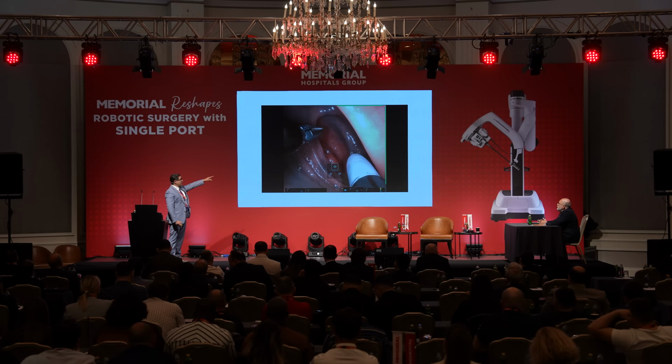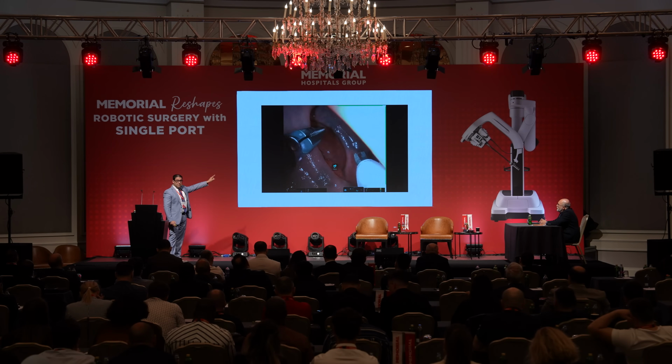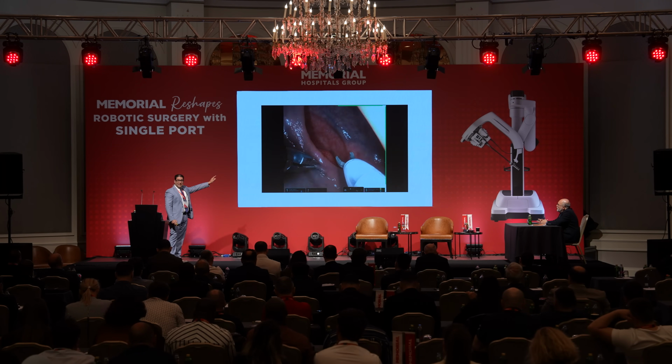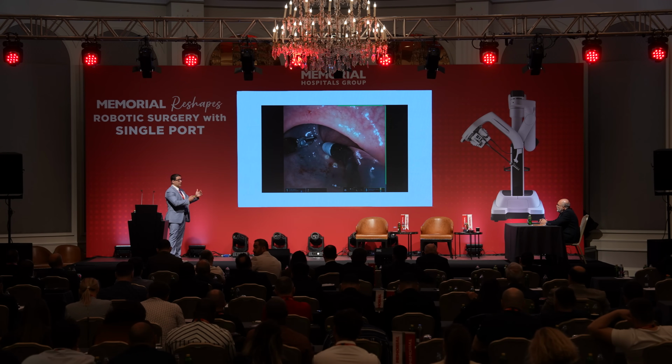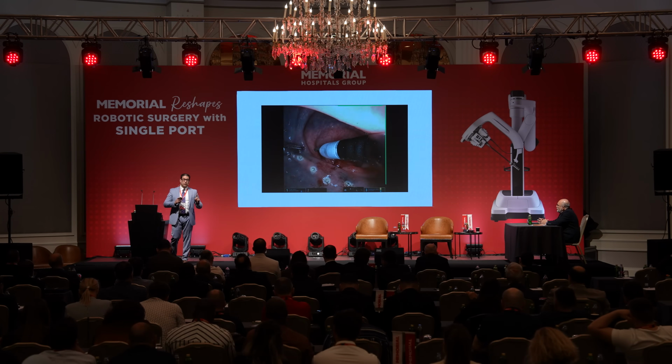This is rectosigmoid, guys. This is deep in the rectum, above the third valve. And you can go there and do whatever you want, which you cannot do laparoscopically, by the way. I would challenge you to do it laparoscopically.